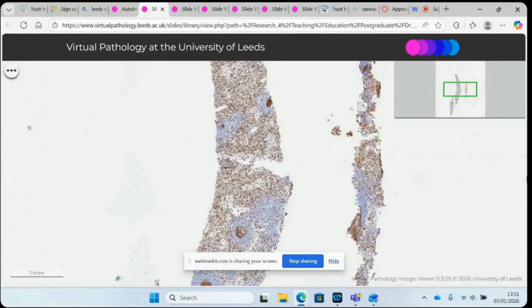So in rheumatoid arthritis, you get some follicular hyperplasia, and you've often got interfollicular plasma cells. And it may sometimes, therefore, resemble the plasma cell variant of Castleman's disease, but in that, you really get massive increases in the plasma cells.